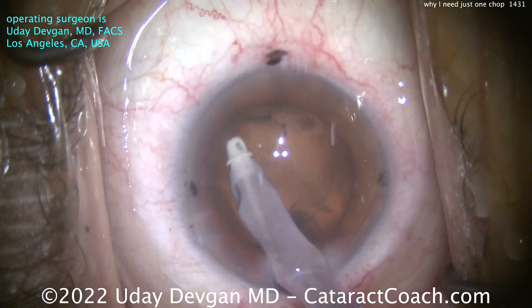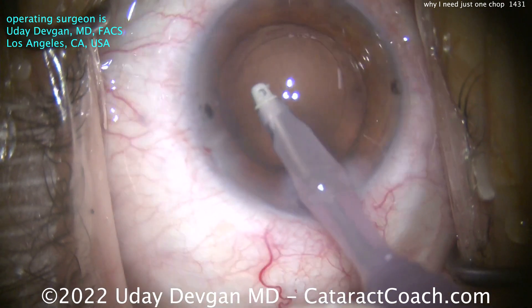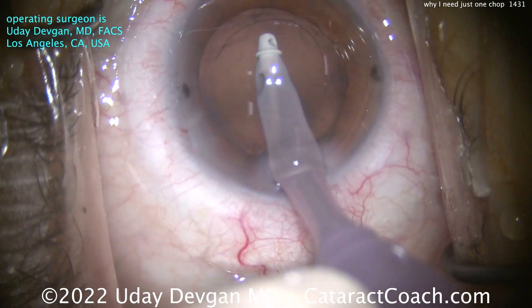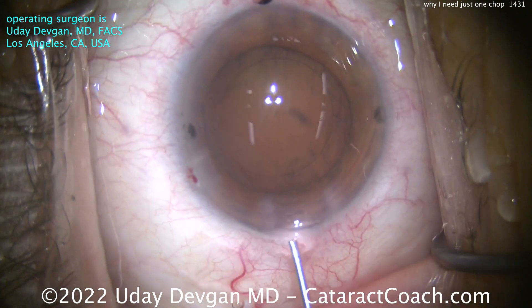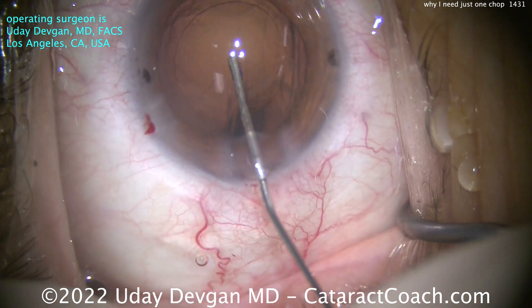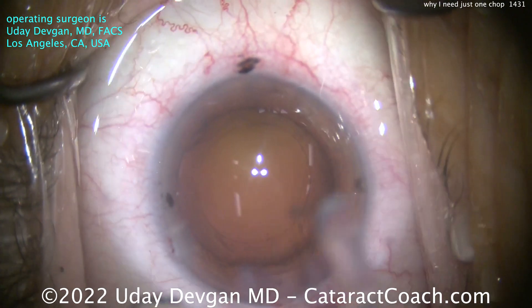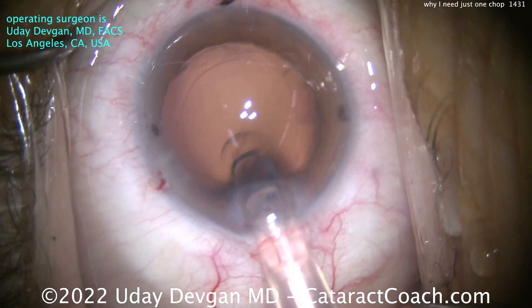That looks great. Now cleaning up the rest of the capsule, taking up the cortex, a little bit of capsule bag polishing. This makes for very efficient surgery. You can see the little black ink marks on the cornea at the limbus — those are at the cardinal meridians. There are already marks on the corneal epithelium showing us where we'll line up the toric lens. Delivering the lens is our next step. The capsule bag is full of dispersive or cohesive viscoelastic. Here comes the lens being delivered.